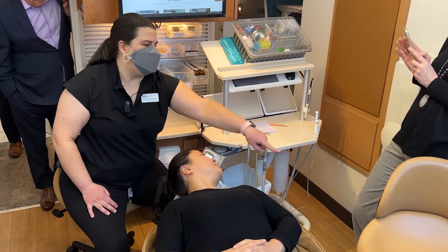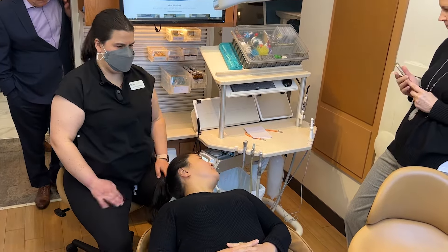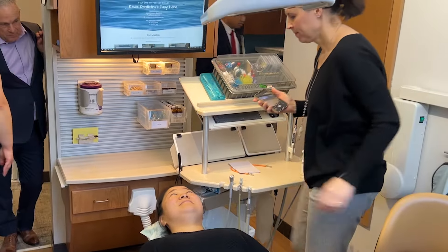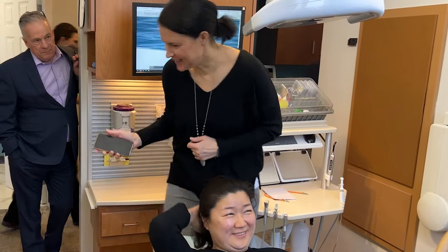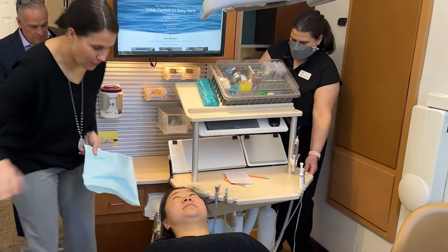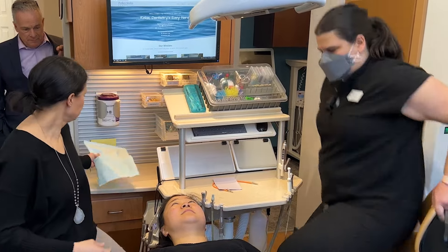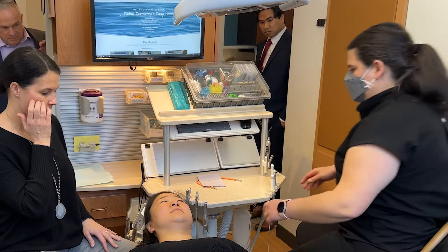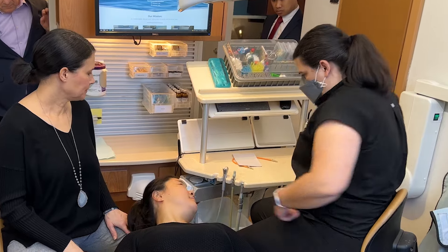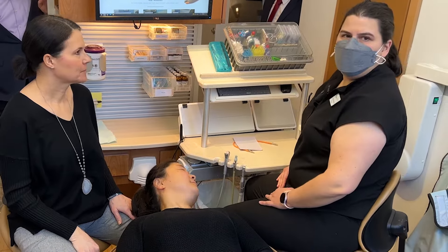So we're going to switch. Dr. Puggett, would you like to sit? Sure, absolutely. So in order for us to work appropriately, I need to make sure that I'm giving Dr. Puggett some space. I need to make sure that she has her hand pieces on her non-dominant hand.